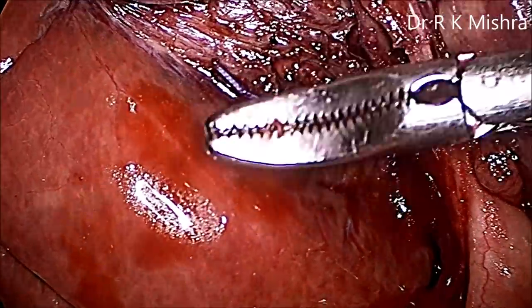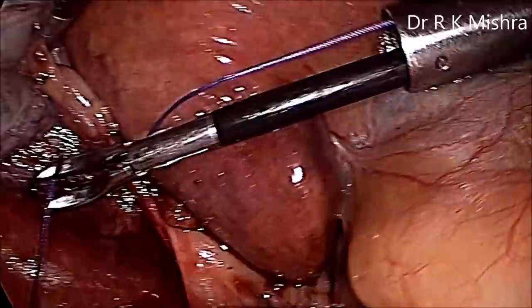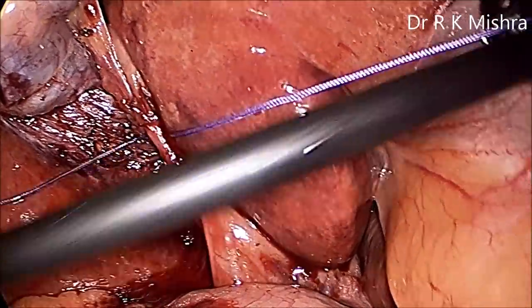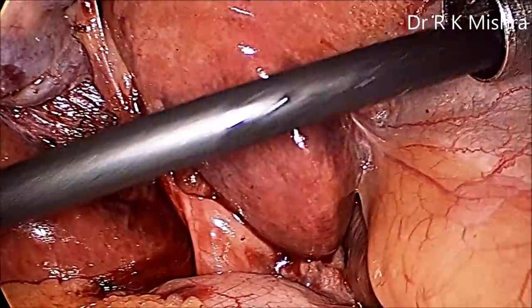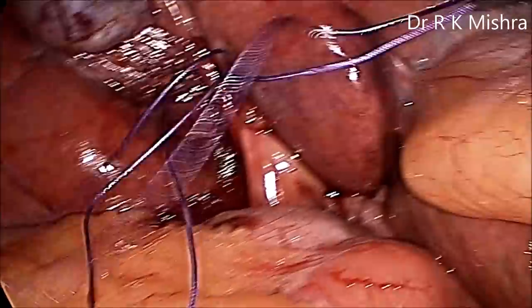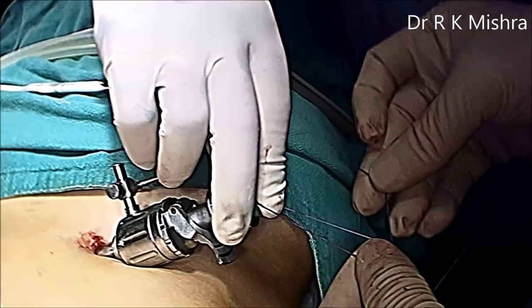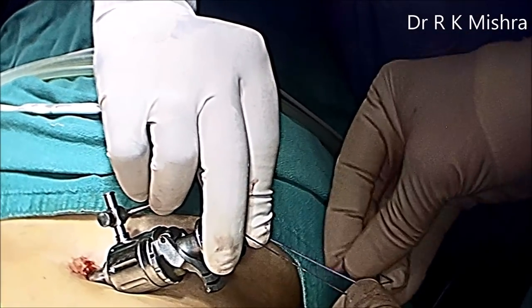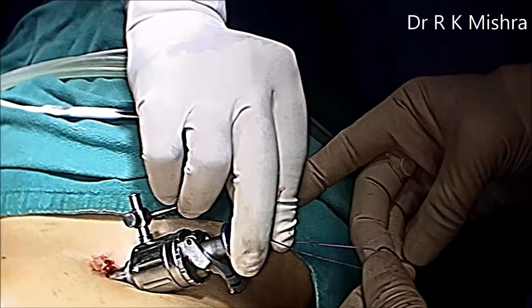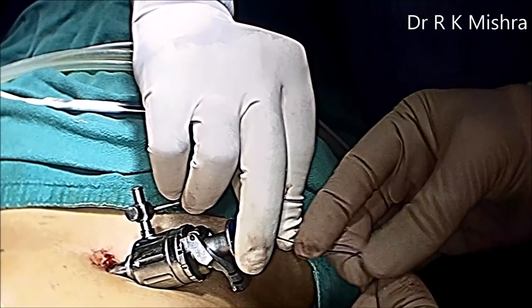Once you are sure of the anatomy, you can tie a knot. In our practice we use an extracorporeal knot for the cystic duct — that is Misra's knot — which is a very secure knot. Even if you want to do mass ligation or subtotal partial cholecystectomy, this knot can help you. The configuration is: one hitch, one wind, one lock, second wind, second lock, third wind, lock — this is Misra's knot.